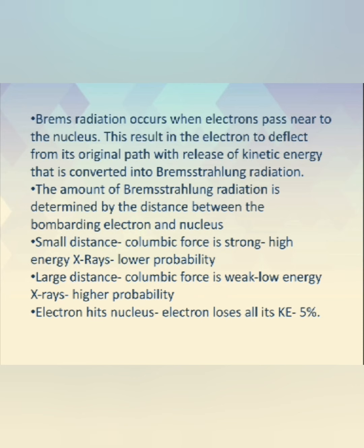Now, if the electron hits the nucleus directly, the electron will lose all of its kinetic energy, but this type of interaction will account for only 5%.